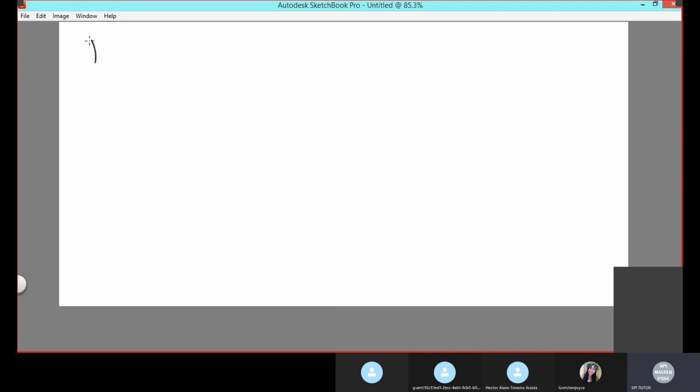All right. Doppler packets. Doppler packets has another name, well, two names. It's called your packet size, and it's called your ensemble length. So you have to remember all three of these, unfortunately. So what does it do?